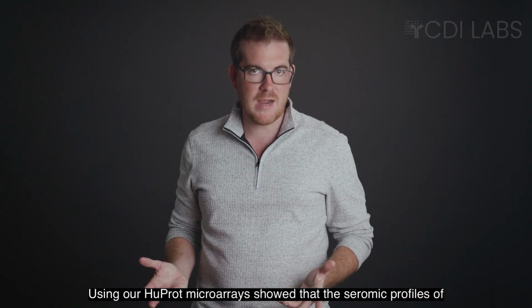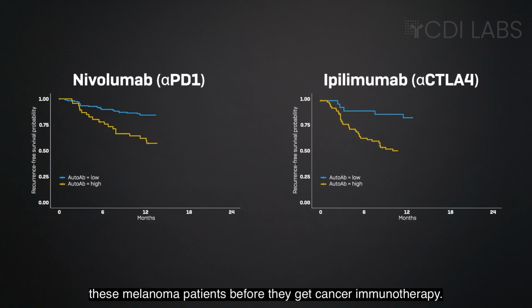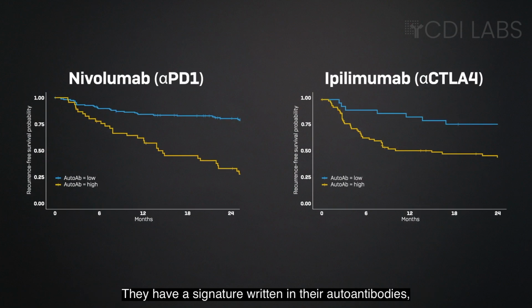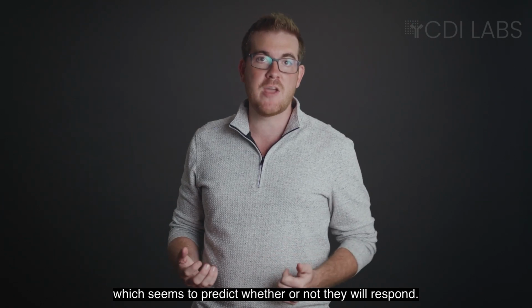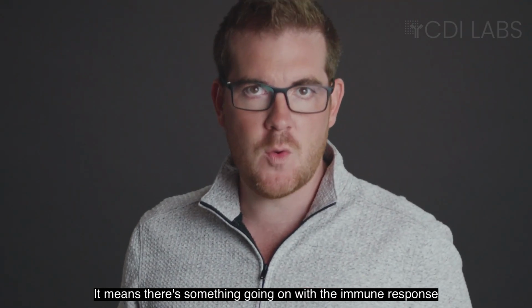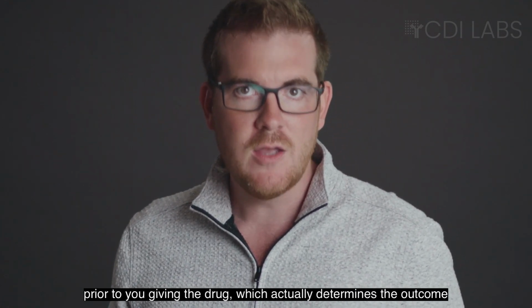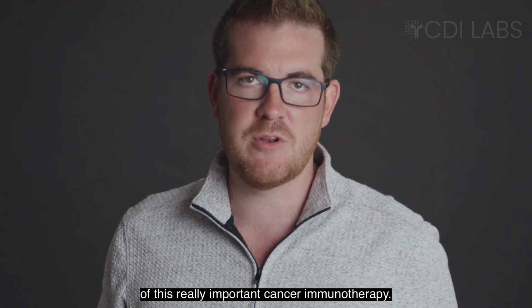Using our HuProt microarrays showed that the seromic profiles of these melanoma patients before they get cancer immunotherapy, they have a signature written in their autoantibodies, which seems to predict whether or not they will respond. It means there's something going on with the immune response prior to you giving the drug, which actually determines the outcome of this really important cancer immunotherapy.